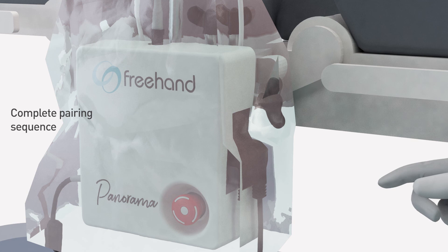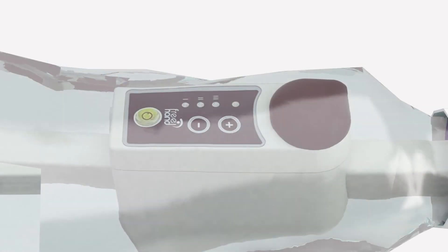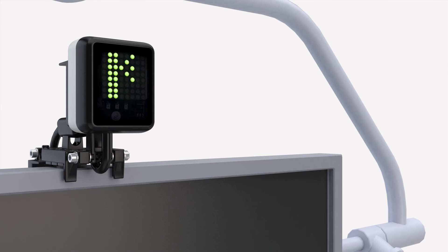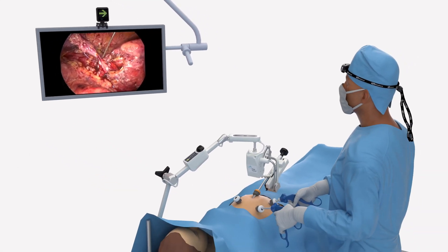Now switch on the control box, taking care not to desterilise the patient drapes. The freehand arm will then perform some diagnostic checks and a pairing sequence. The speed of movement is indicated by the amber light and can be altered by pressing the plus or minus buttons. The arm will now be paired with the other components and the indicator unit should display directional arrows, meaning the freehand cobot is ready to use.